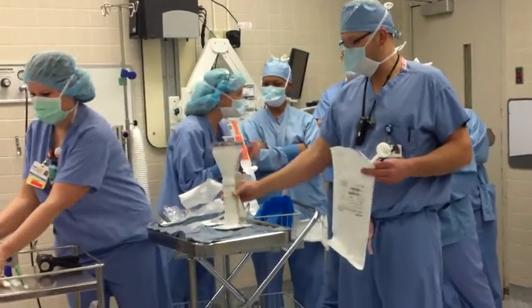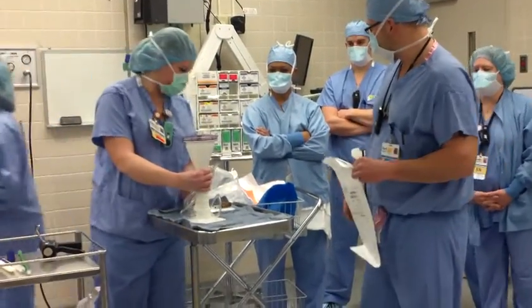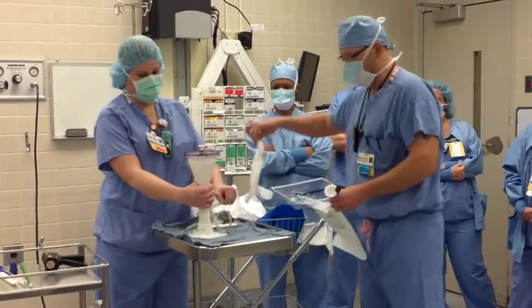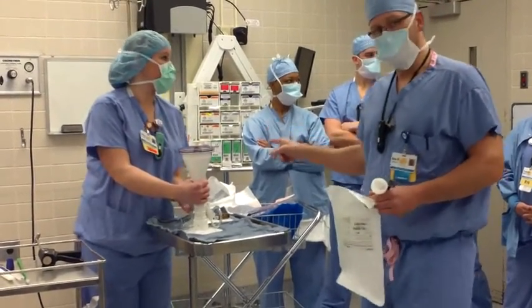Mostly the one I'm worried about is this. This is the one that gets people in trouble because there's a few steps to it. So what you have to have is this disposable kit here, which comes with this orange wrapper on top of it. The orange wrapper has an implant in it.